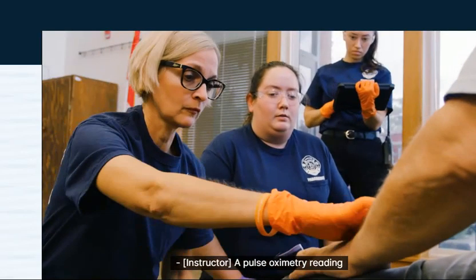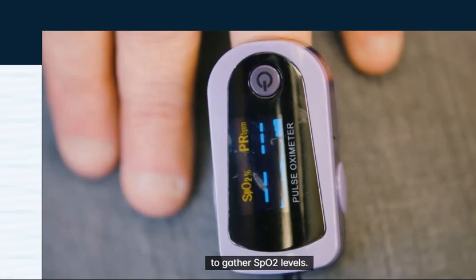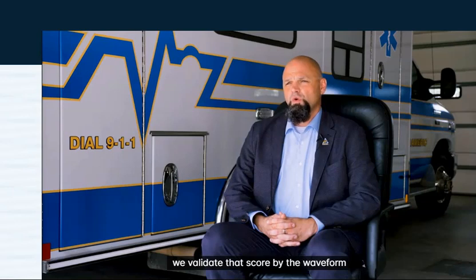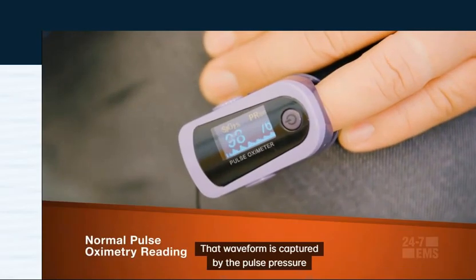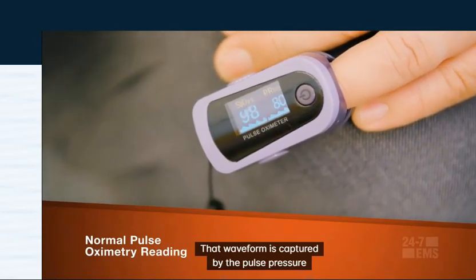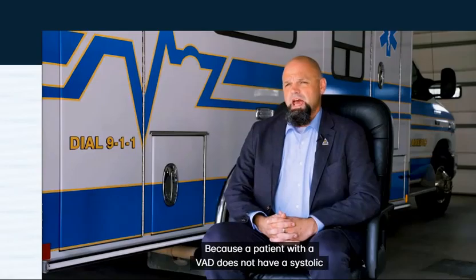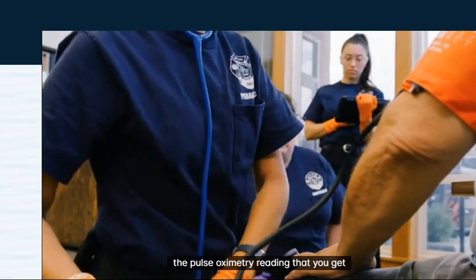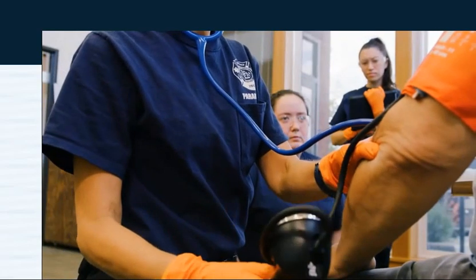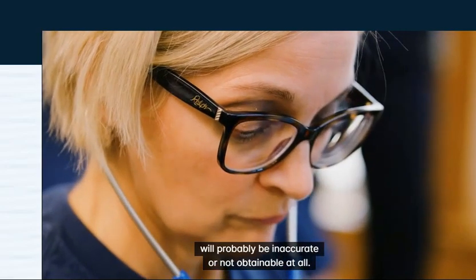A pulse oximetry reading for a VAD patient may be inaccurate, as these devices typically rely on a pulse wave to gather SpO2 levels. When we use a pulse oximeter, we validate that score by the waveform on the pulse oximeter itself. That waveform is captured by the pulse pressure and the beat-by-beat systolic and diastolic. Because a patient with a VAD does not have a systolic and diastolic or beat-by-beat pressure, the pulse oximetry reading that you get will probably be inaccurate or not obtainable at all.